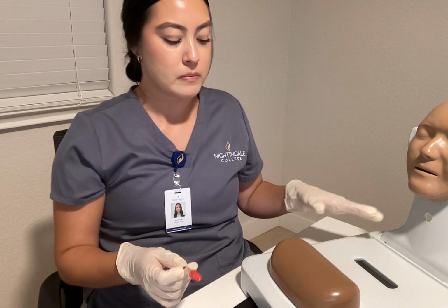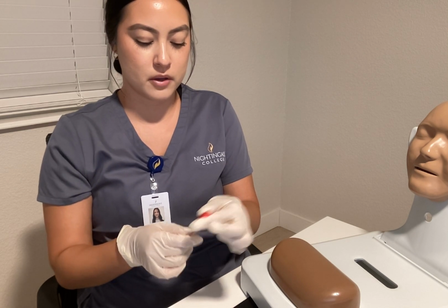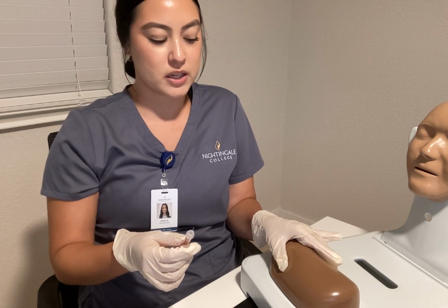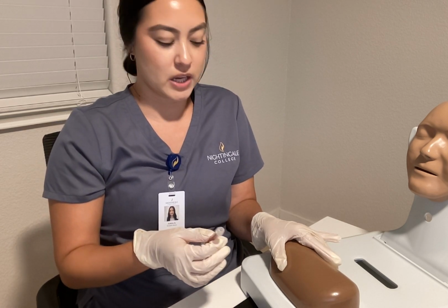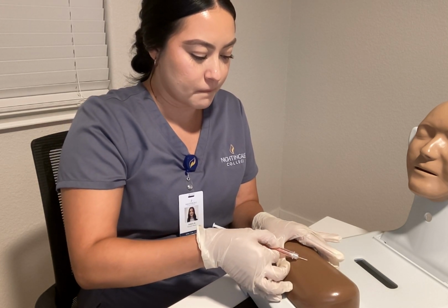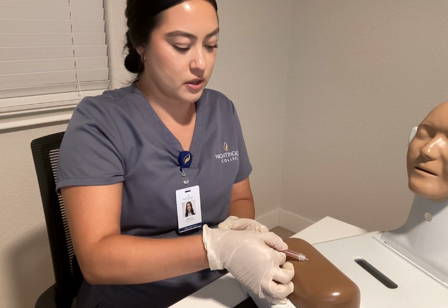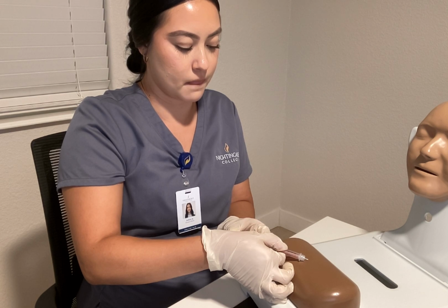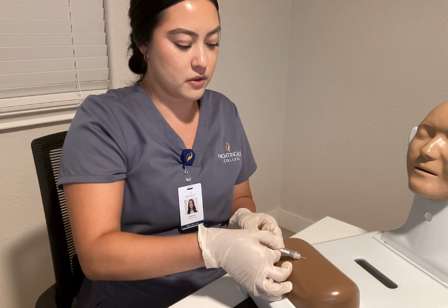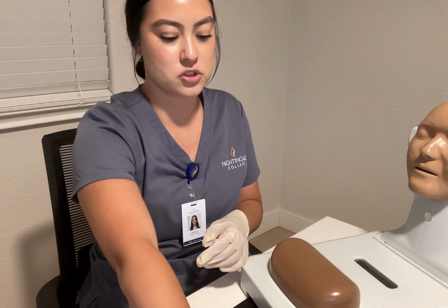Once that's done, you're going to go ahead and visualize your site, and you're going to uncap your needle, and we're going to pinch it, and with injecting it, you want to go in at a 45 to 90 degree angle. So we're going to hold this here and inject and let go, and we're going to push in the medication. Going to withdraw the needle, and we can go ahead and cap this and discard this into the sharps container.